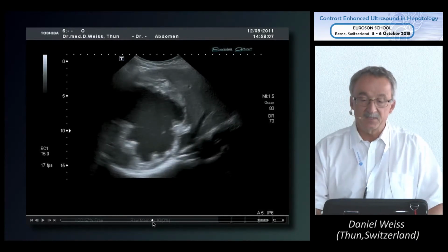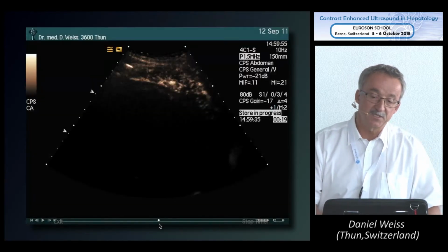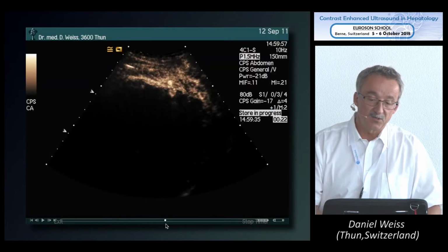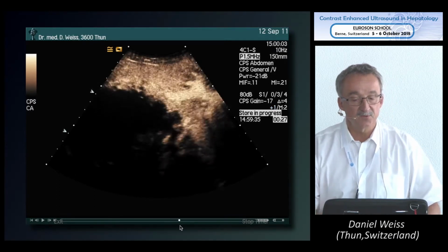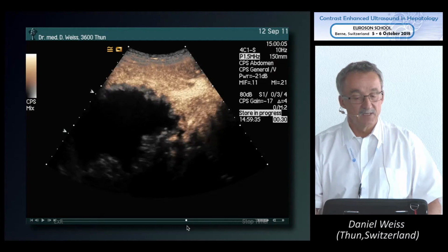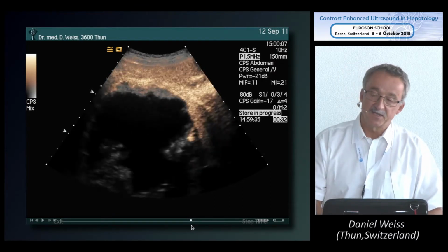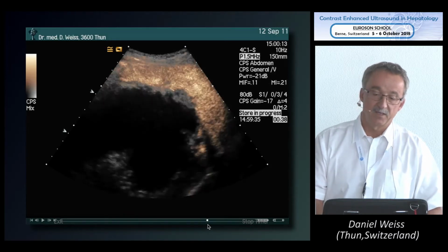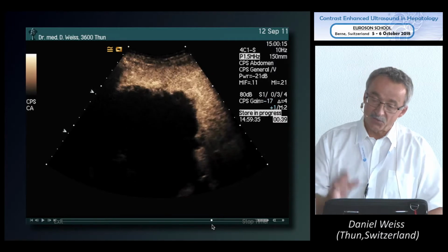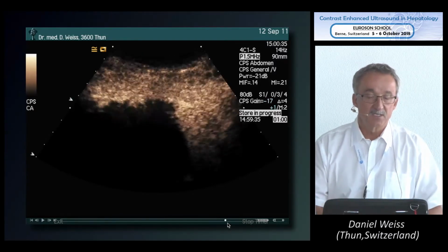So here you have to say, this is maybe a typical picture. Of course, you have in this situation always to do a serology, and when you look at the contrast enhanced ultrasound, again the same as I showed you before, but this time with a large necrotic liquid area inside. This is not an abscess. This is a bile erosion, contact of bile fluid with the echinococcus, which makes you such a picture.